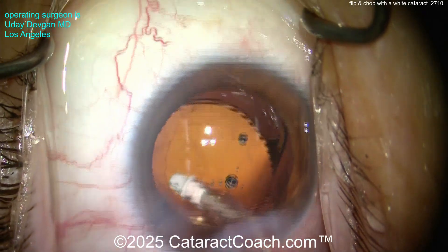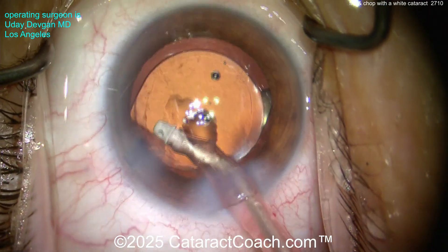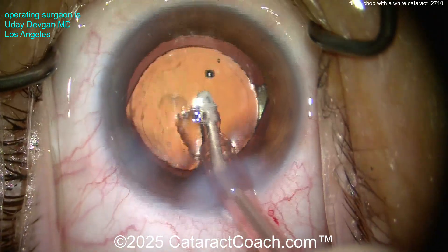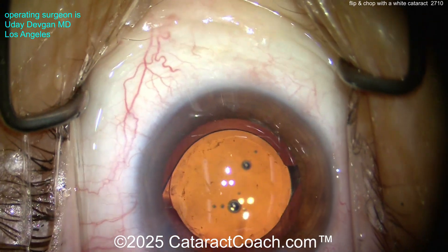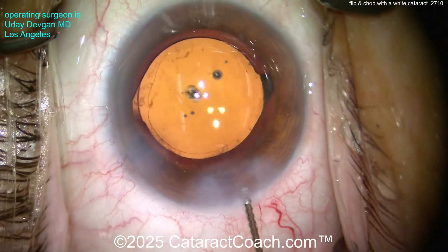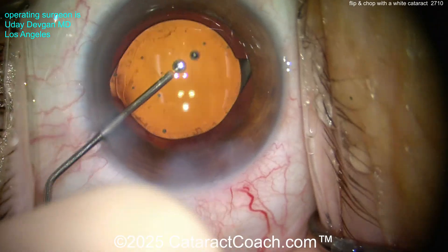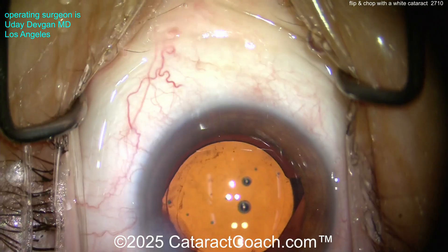Think about that: the lens is already in the bag. There's a saying in U.S. medical training — perfection is the enemy of very good. You can have a very good case, then go chasing perfection and end up with a complication. So hydrate the incisions, seal them up. Look at those beautiful incisions. Let's make sure there's nothing else in the eye — looks good. Centration on the IOL looks good.